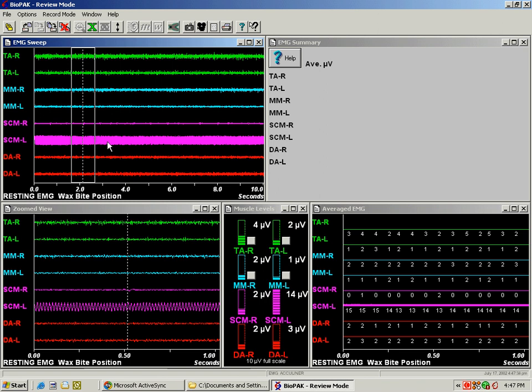When this thick band shows up, what you want to do is look in the zoom view. If you see this sine wave, you notice how this muscle activity goes up and down, or this electrical activity goes up and down in a very regular pattern. That is indicative of electrical activity.